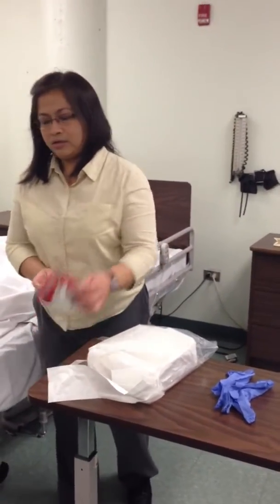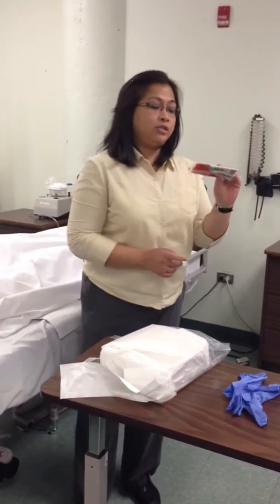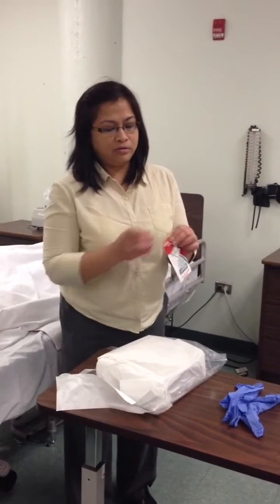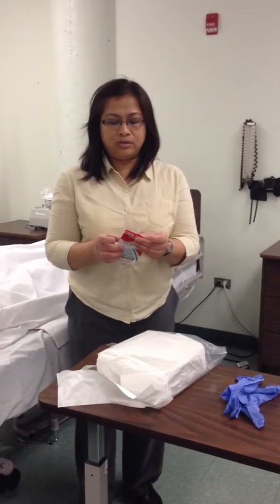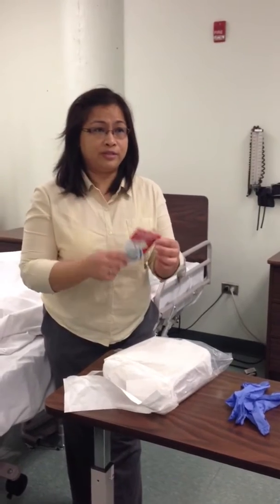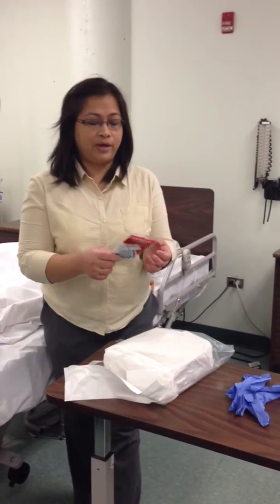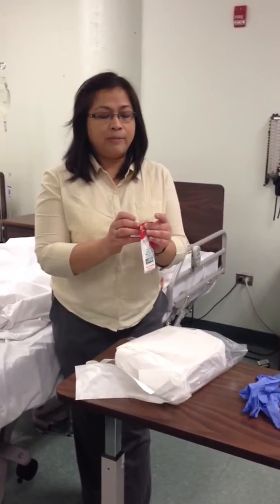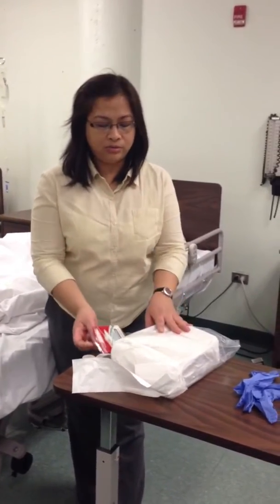But we have the securing device, but I'm sorry to tell you that you can only use this one for the test, because we only have a few of these, just enough for the test. Okay. So for practice, you can use this securing device, but this is very easy. I'm gonna show you how to use this.